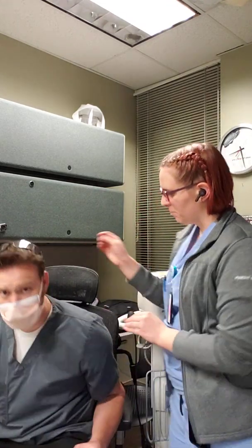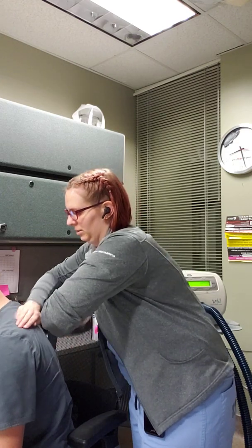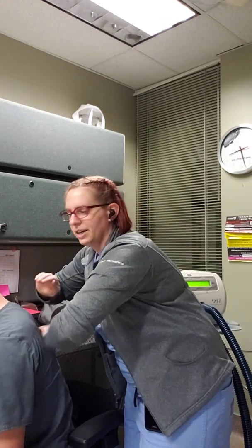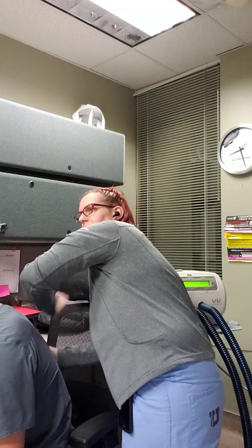For example, you want to make sure your hands are in cupping position and that your wrists stay loose because you're trying to get a cupping pop while you're doing CPT over areas where there might be consolidation. As you can hear, there is some popping. And you would continue to do that for 20 minutes, specifically over areas of consolidation.